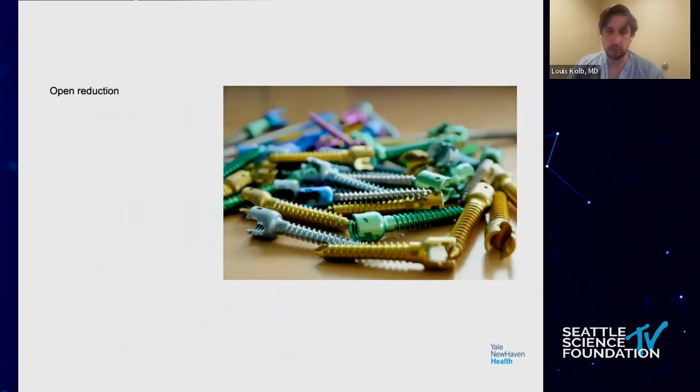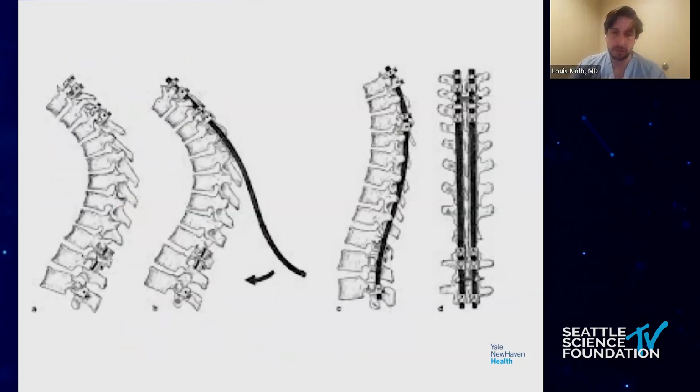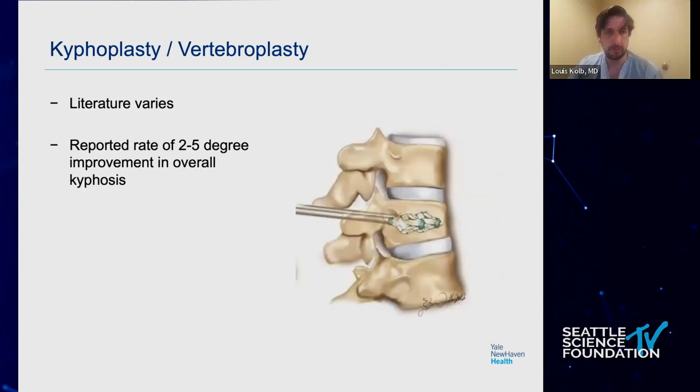Open reduction techniques with screws, very familiar with. Cantilever techniques, among others, or using posts or reduction towers can really reduce the contouring of your rod preoperatively, or reduce the kyphosis. It can also achieve quite a reduction of the deformity itself.